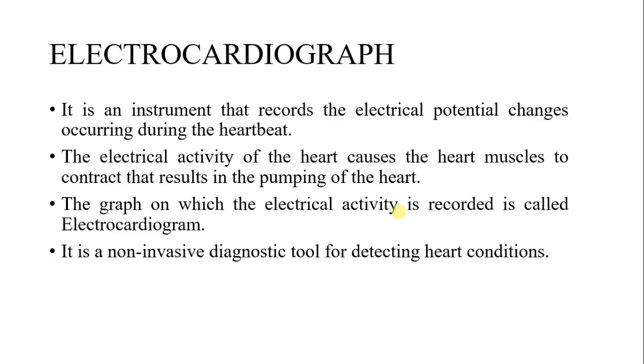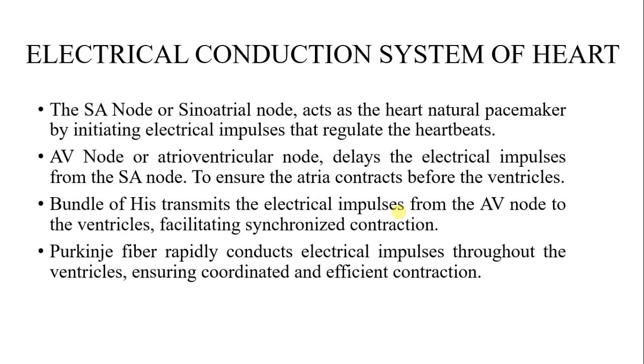The electrical activity of the heart causes the heart muscles to contract, which results in the pumping of the heart, and the graph on which the electrical activity is recorded is called an electrocardiogram. It is a non-invasive diagnostic tool for detecting heart conditions. It can help in detecting many heart conditions, which can be helpful for the patient's health.